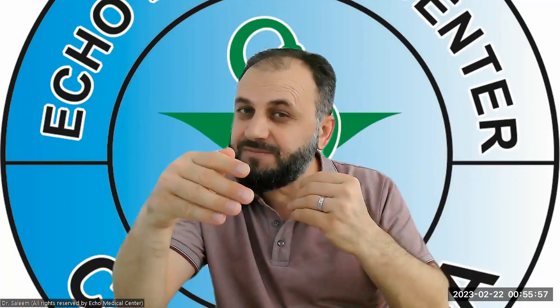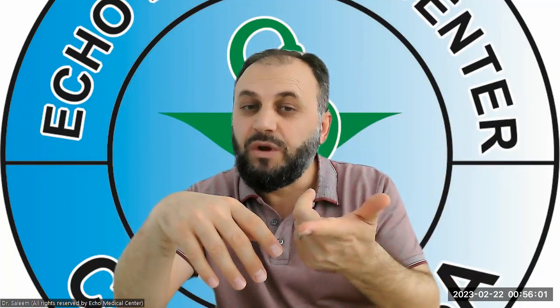And my reason for not taking pulse wave Doppler on that area is because we understand there is physiologic turbulent flow where the bulbous area is. It just creates confusion, because when you take the pulse wave Doppler on that area, the spectral waveform will show spectral broadening, which is an indication of turbulent flow. So let's not create that confusion.